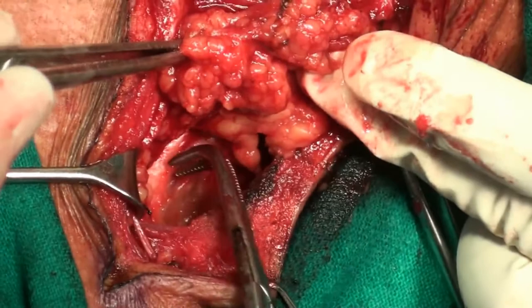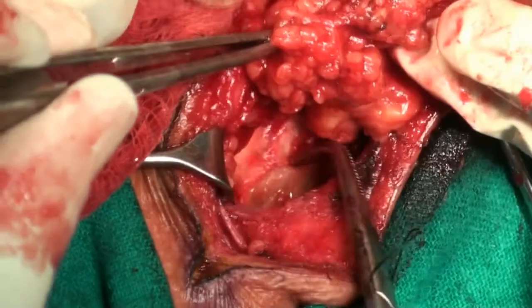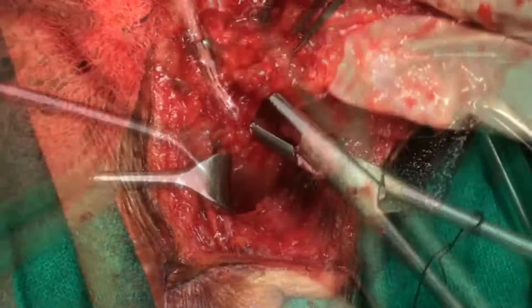You see the white thing underneath? That's the brachial plexus, and what is covering it is fascia. We'll just stay superficial to it and we are fine. Get my point? Tight. I see the, here we come out. I just clear this entire thing off.